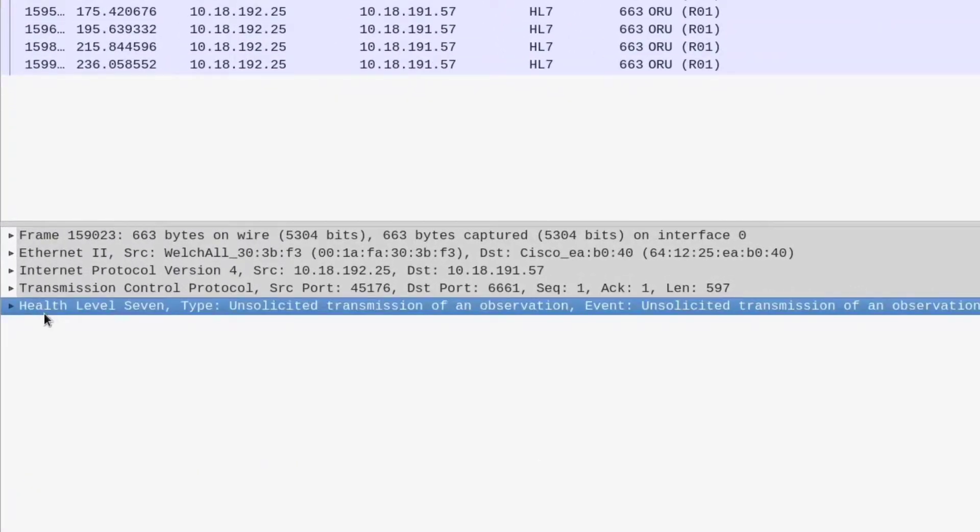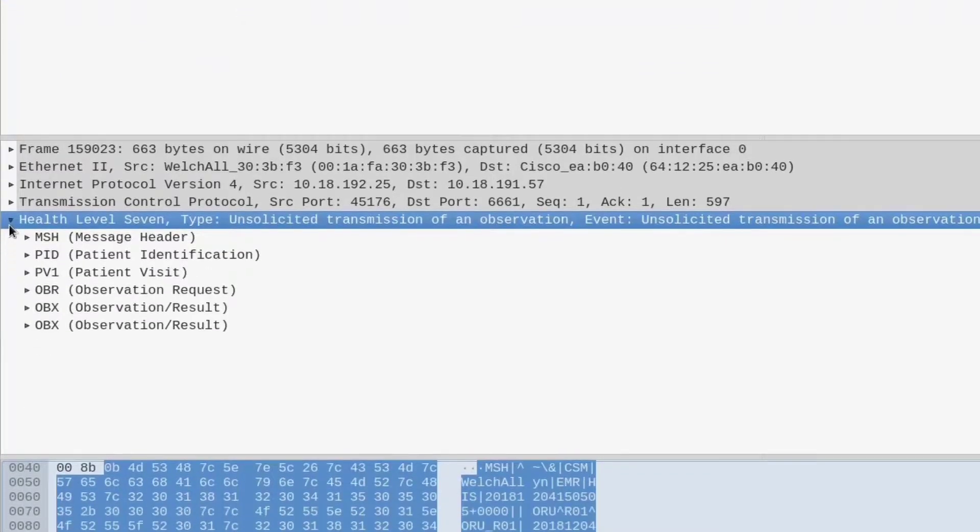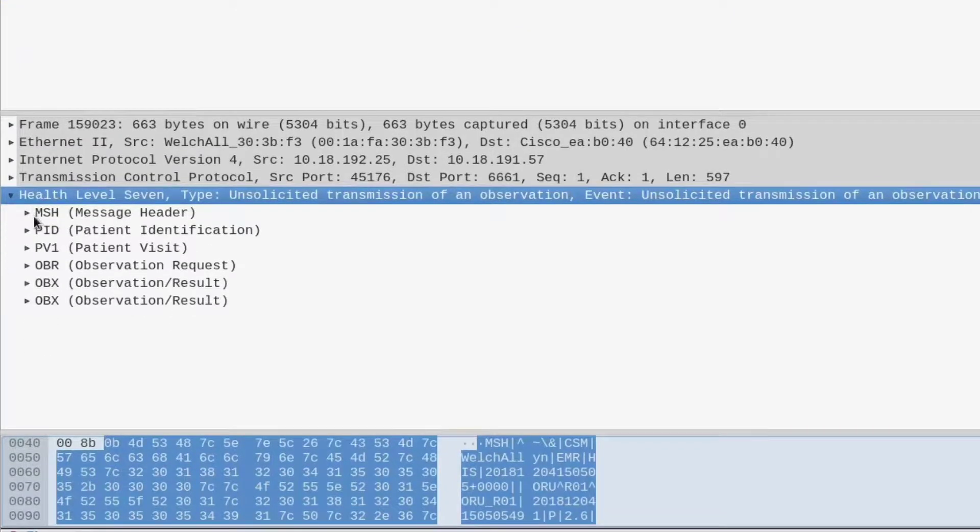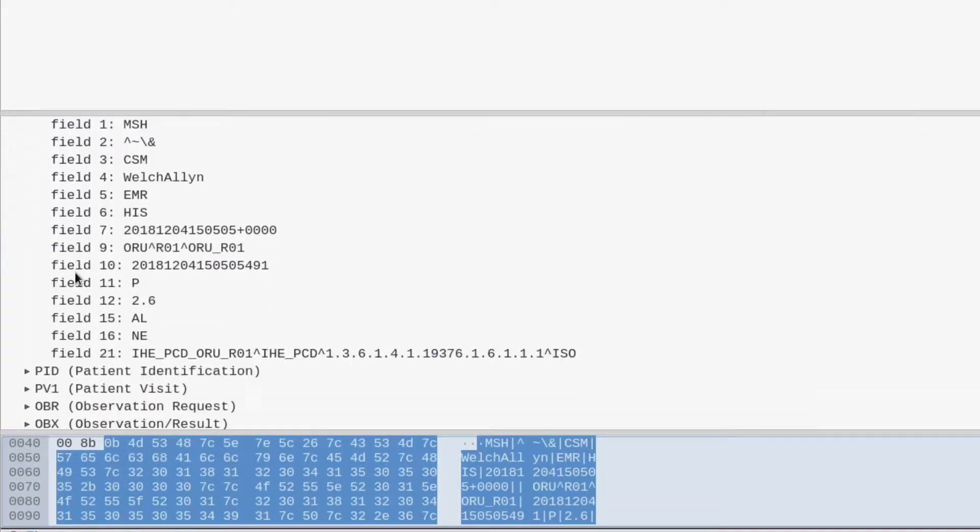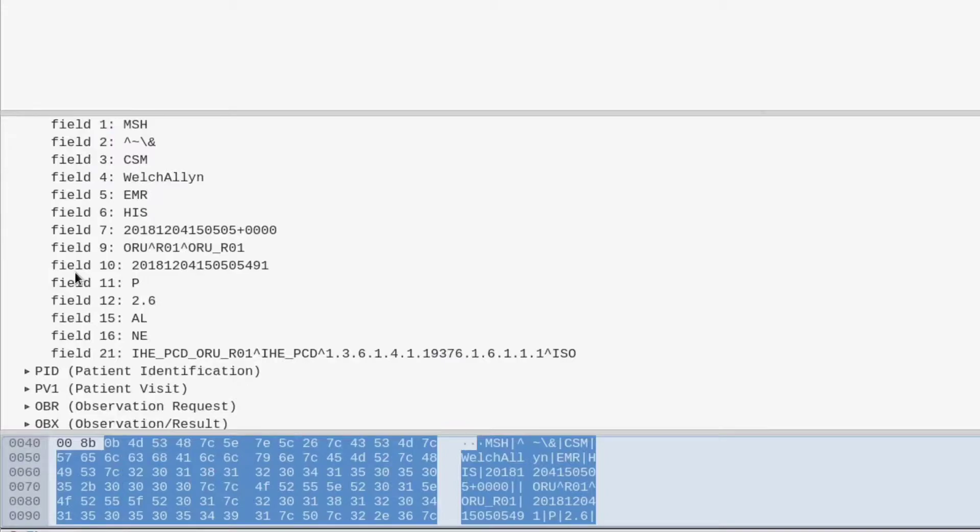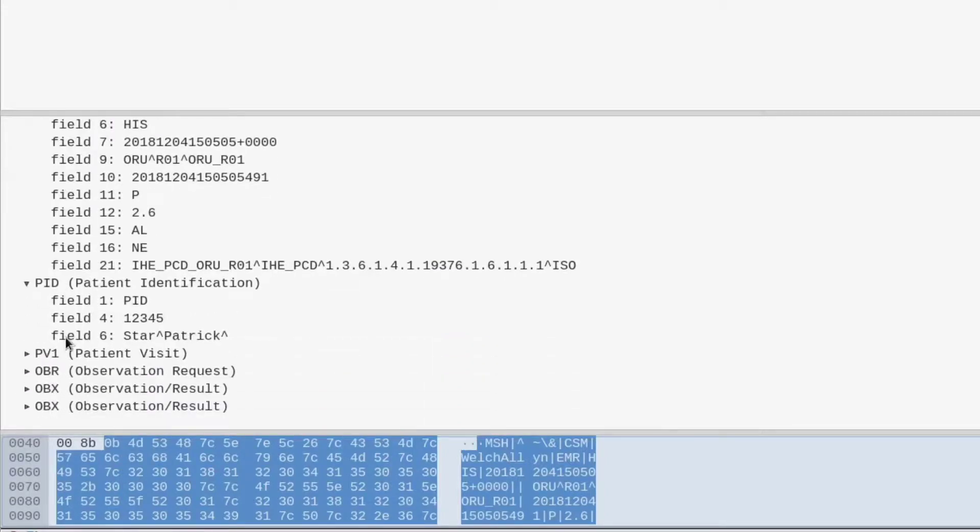Down here you can actually see in Wireshark there's a built-in module just for HL7, and it will start pulling out the individual pieces of information of HL7.